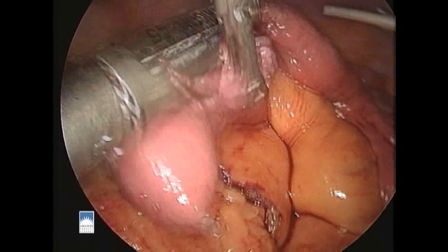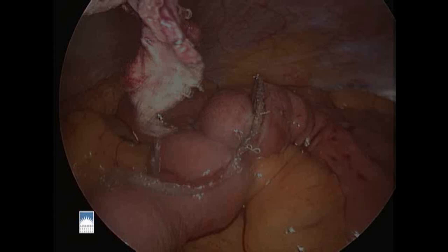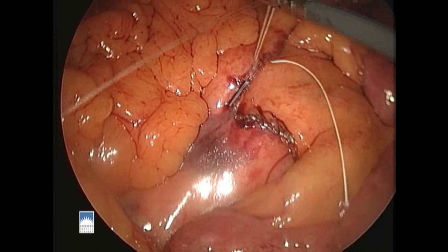We now have a single opening in the wall of the bowel and this is closed transversely with further firings of the stapler. We do this in a careful way so as not to narrow the openings of any of the loops of bowel. After placing a few clips along the staple line to help control oozing, we'll use a suture to close the gap in the fatty drape between the two loops of bowel where we've made our new anastomosis.